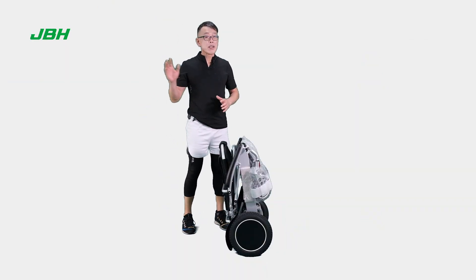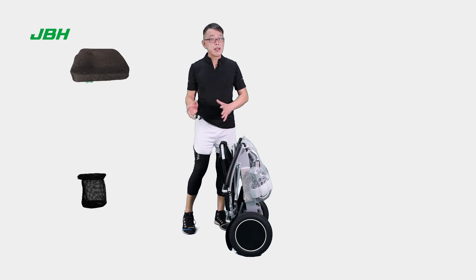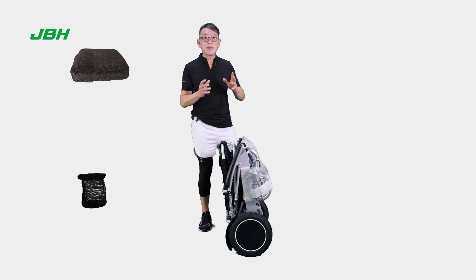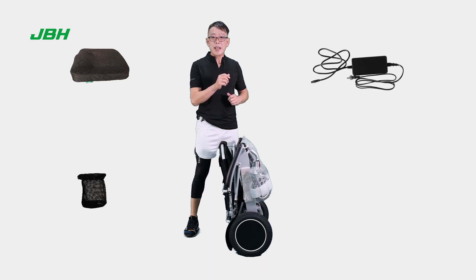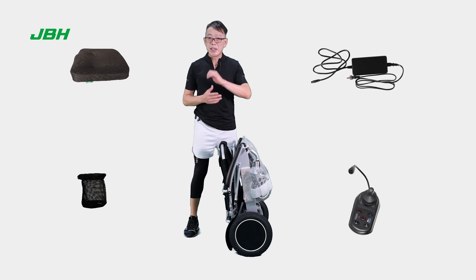Right now, you will find a seat cushion separate with the wheelchair and also some simple tools with a user manual and a cable in the pack, a charger and also a controller, with additionally a cup holder. I'm going to show you those later.